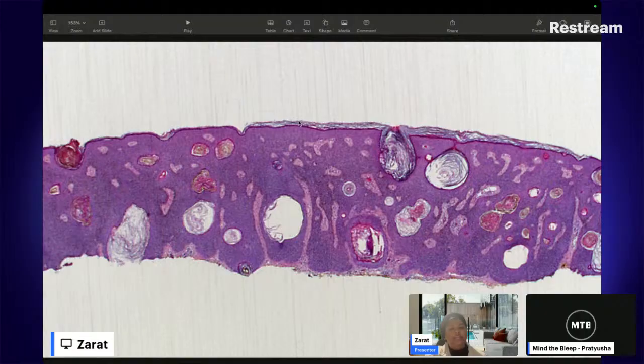And then we want to see where the abnormality is. So as I said, there is the epidermis and then we have the dermis. I know that we can't see much of the dermis, but we can definitely see that the epidermis looks much thicker than it normally would, than the slide we saw before. So I think we can safely say that the abnormality is in the epidermis.